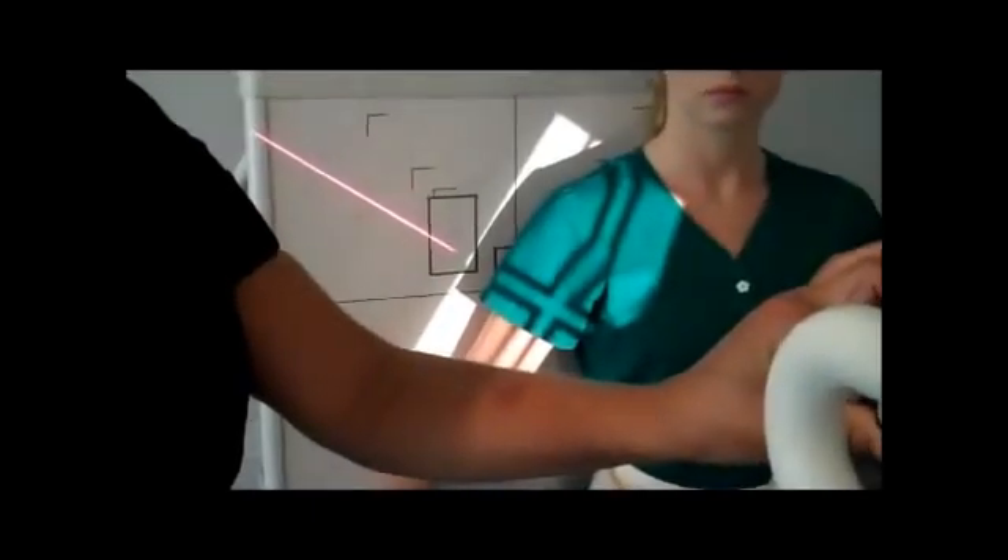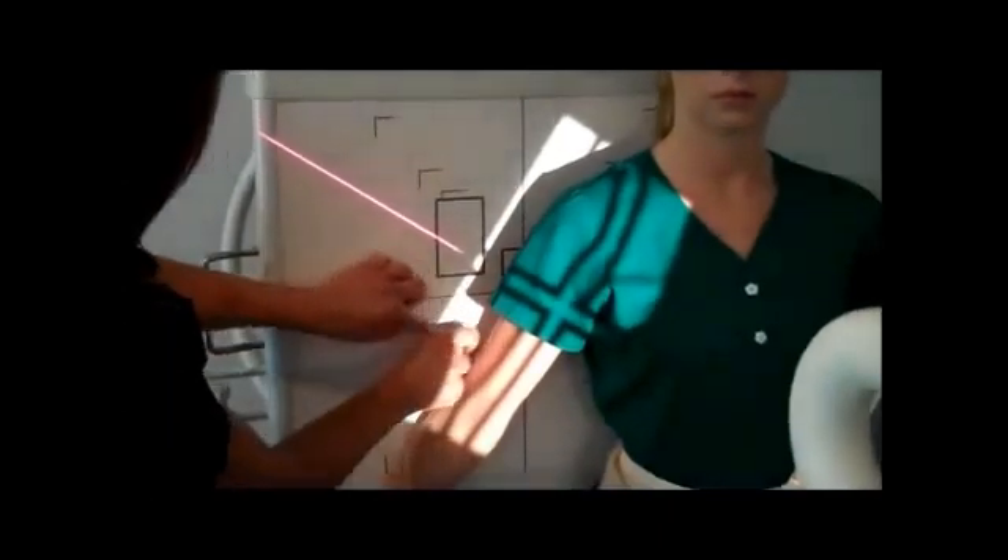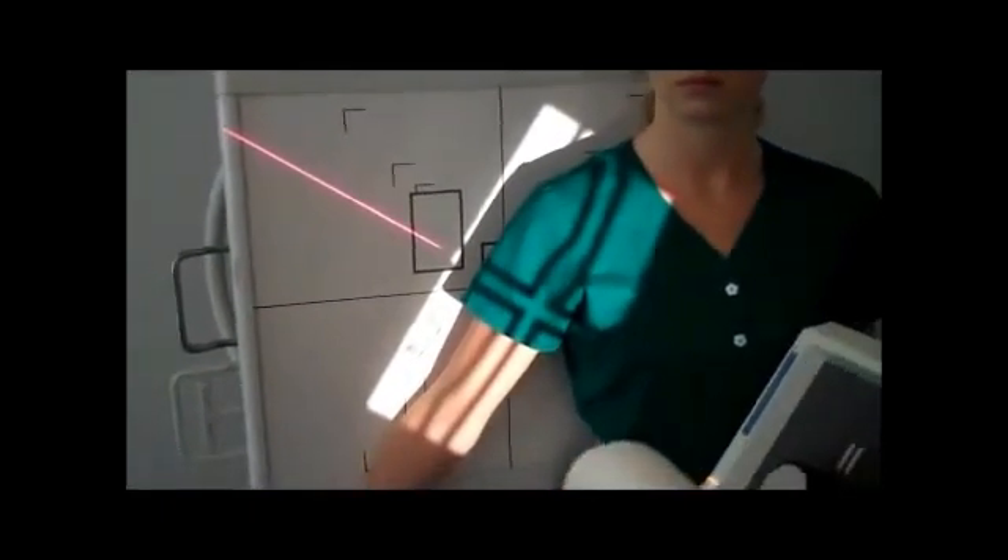We'll collimate to include the shoulder joint and the elbow joint, and then we'll need to mark it with the right marker on the lateral aspect. Suspend respiration.